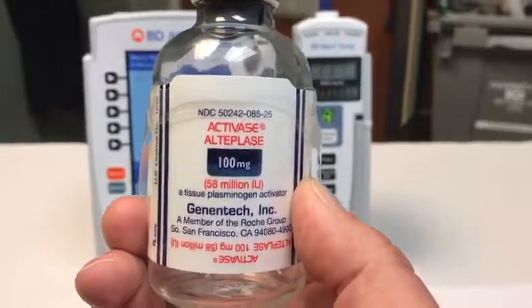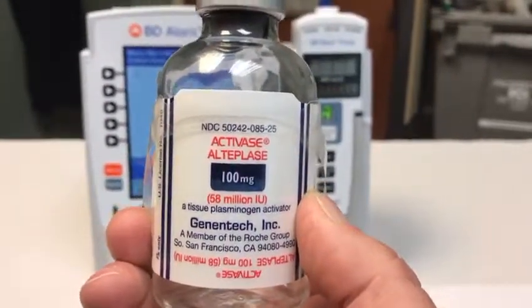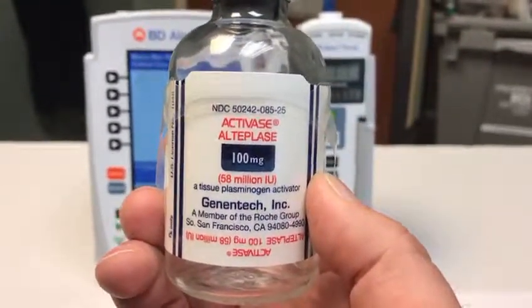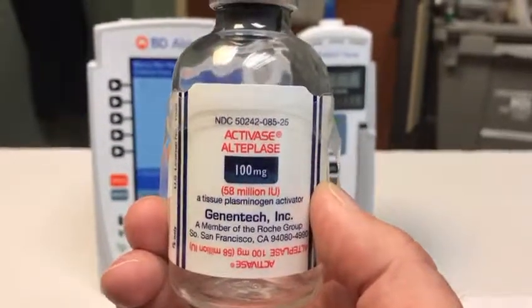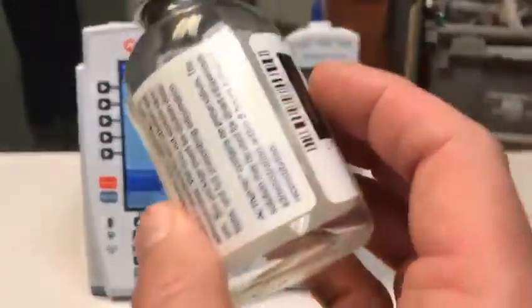So it is a 1-to-1 infusion. It is a dual verify. So anytime we're giving TPA, we should have a second nurse verify. But in this condition, pulmonary embolism, alteplase or TPA, 100 milligrams in 100 mils is going to be given over 2 hours. So it's a 2-hour infusion, and that will come out to 50 mils per hour on the pump. So again, this is how the pharmacy is going to provide the TPA to you.